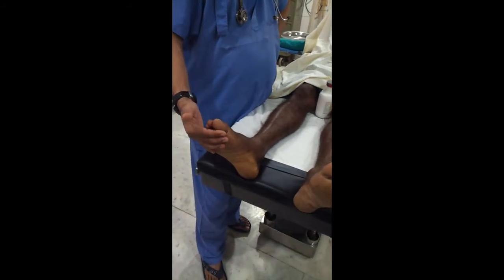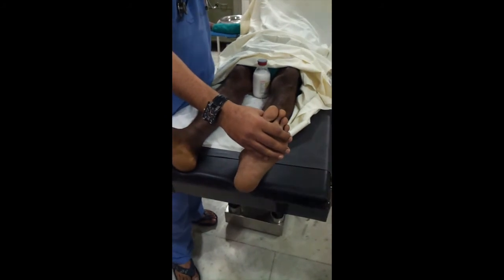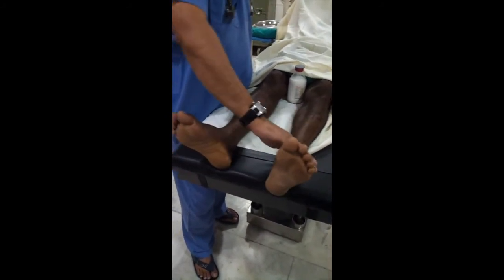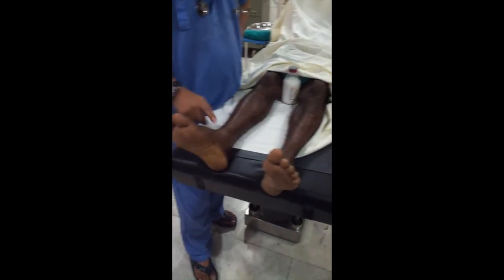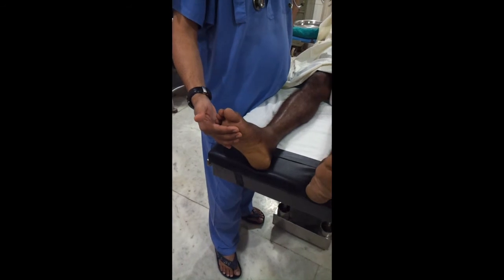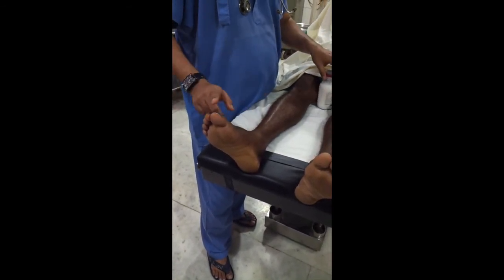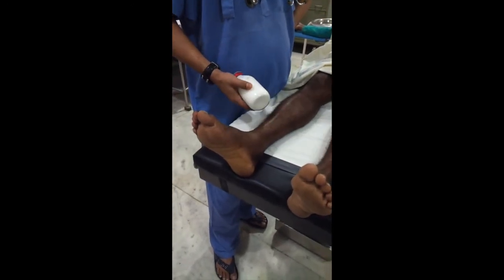This is the normal limb and this is the blocked limb. Push — nothing is there, so the nerve block is done. Now look for the temperature sensation.